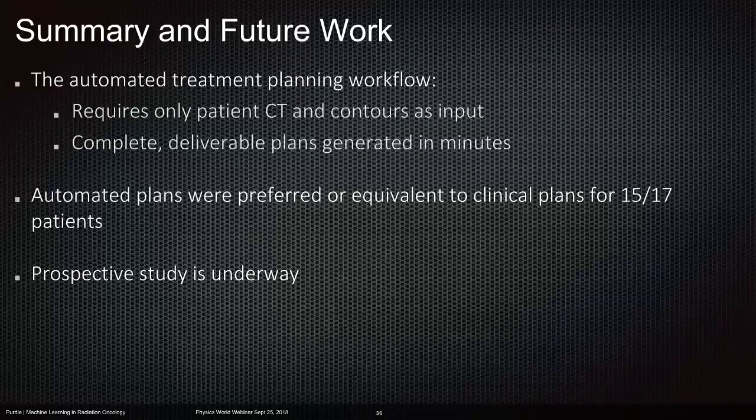If you have a treatment plan that was done at some nominal energy, like, say, for example, 6 MV for a VMAT case, even though there might be small differences between clinics in terms of how their beam model performs, if we're talking about a LINAC-based treatment, for example, then those differences are extremely minor in terms of how this works, because the mimicking step in terms of generating the plan does incorporate your beam model.